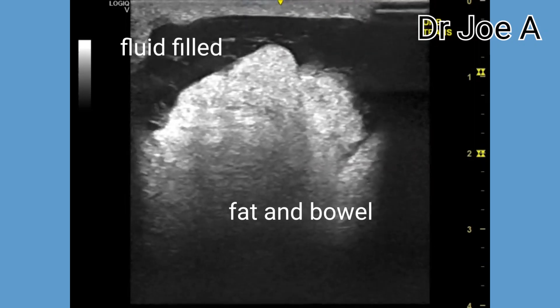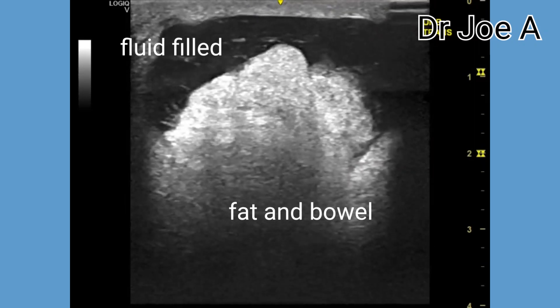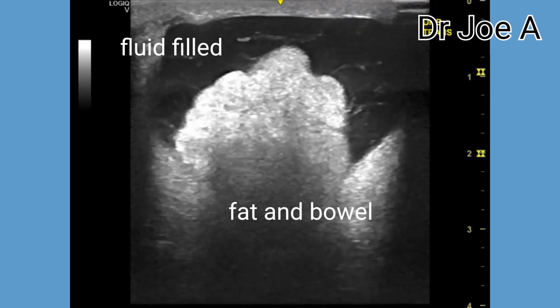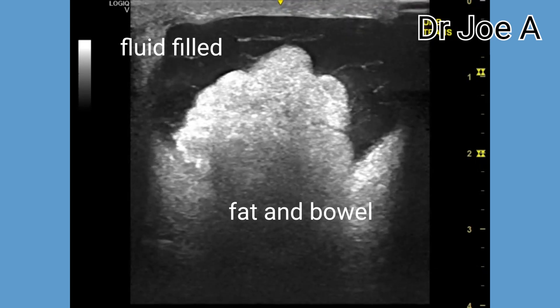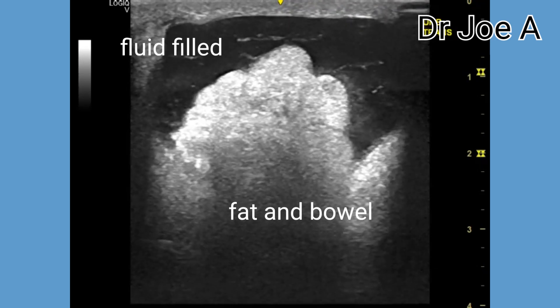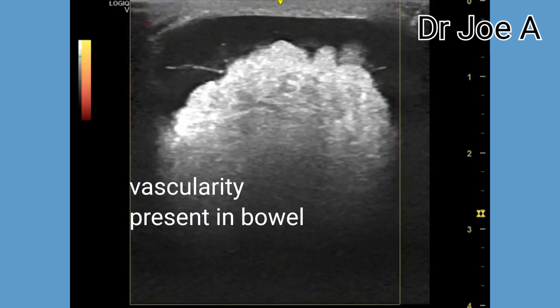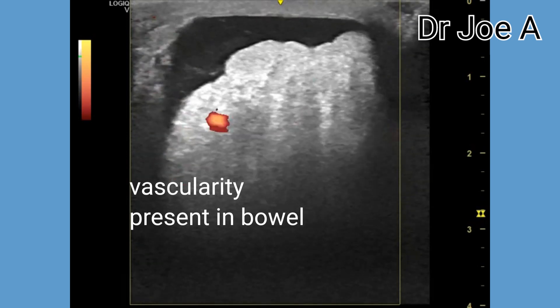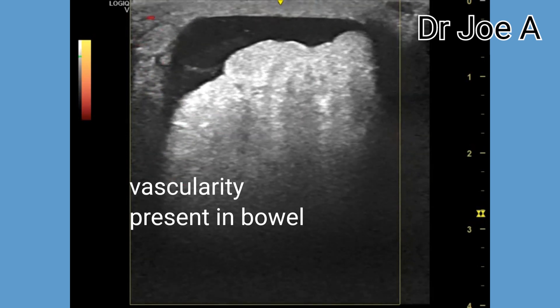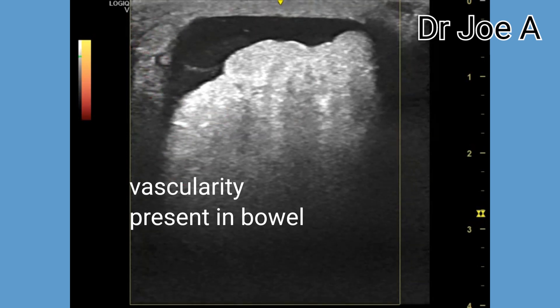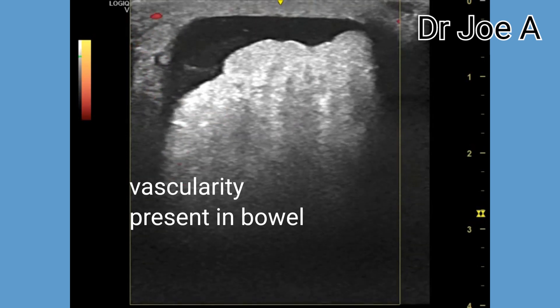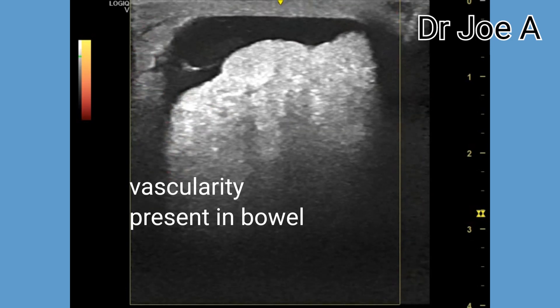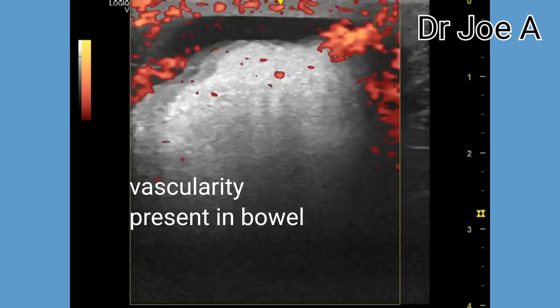The fibrinous strands are seen as hyperechoic bright linear structures within the fluid-filled cavity. The radiologist or sonologist should carefully evaluate these structures to determine if they are truly mesenteric fat and fibrinous strands.